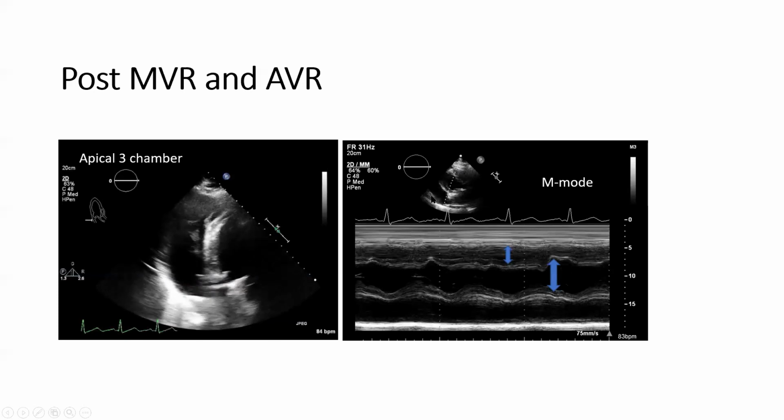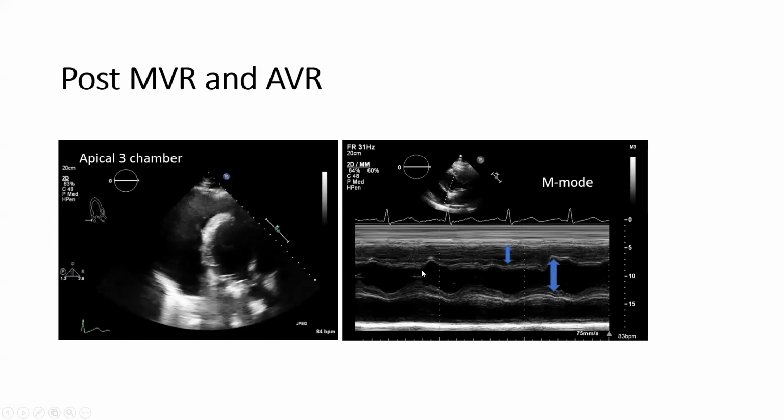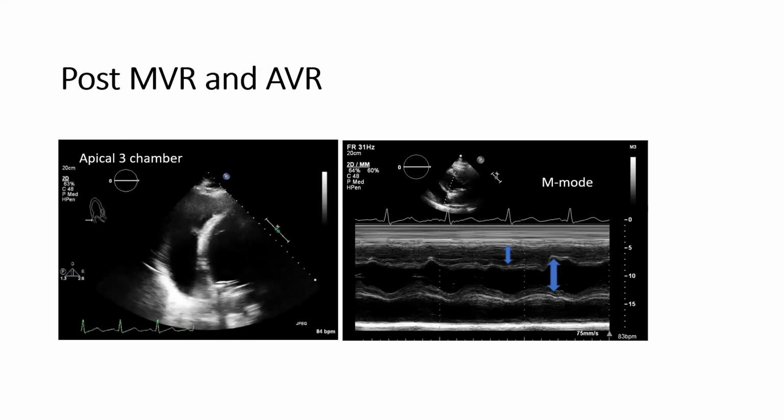This is an M mode through the parasternal long axis view, somewhat oblique, but that doesn't matter, but it shows the very chaotic movement of the septum and the reciprocal relationship between RV size and LV size. When RV is bigger, LV is smaller. When LV is bigger, RV is definitely smaller. So the septum has to move back and forth. And what is very characteristic in ventricular interdependence is this abrupt change in the septal orientation, which clearly means that this is not a slow respiration related change in RV and LV size. So this M mode is an example of ventricular interdependence.